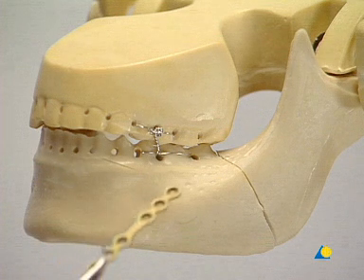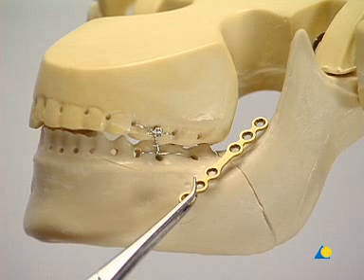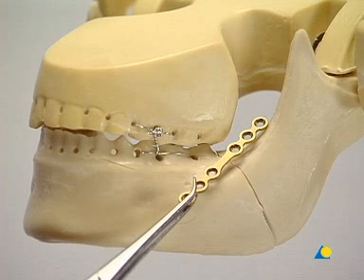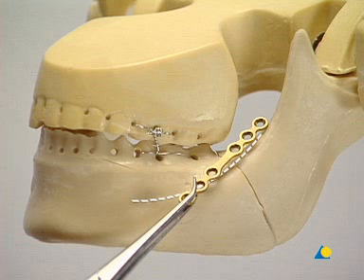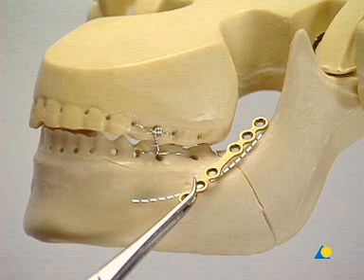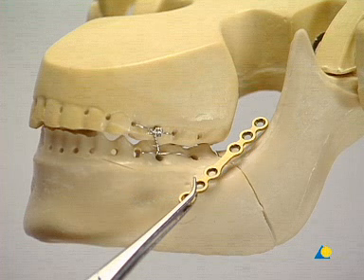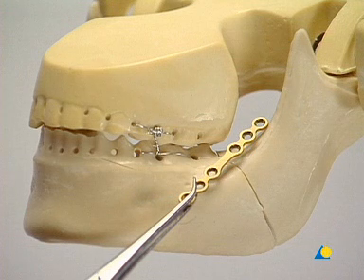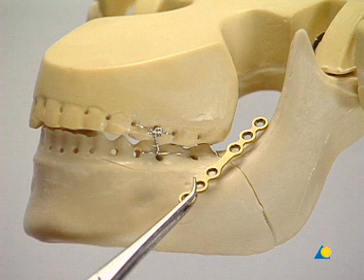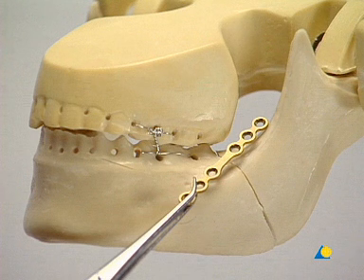A six-hole 2.0 mandible mini plate with center space is placed on the oblique ridge of the mandible along the ideal line of osteosynthesis, as described by Champy. The plate must allow for at least two screws in each main fragment and sufficient distance between the fracture line and the closest screw hole.